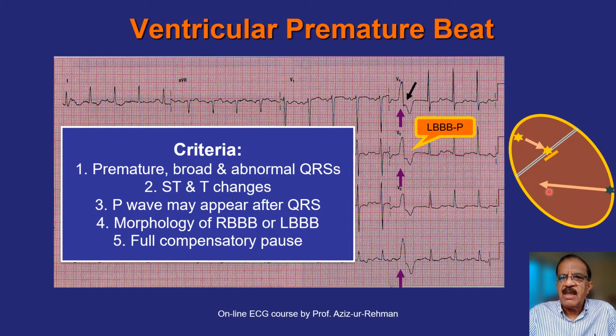So this is a case. This was not exactly this person, another person. There is an ectopic focus say in here, the left ventricular apex. Now this would produce a depolarization wave which goes this way, because this is the side of the myocardium. Of course, it will have to go in the direction of the rest of the myocardium. It will spread in all directions, this way and this way. It will depolarize the entire ventricle, but the net flow of current would be this one, and that would be shown on ECG, and this would perhaps show as a right bundle branch block pattern.